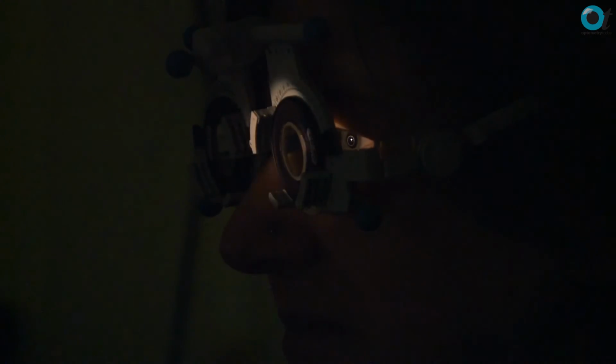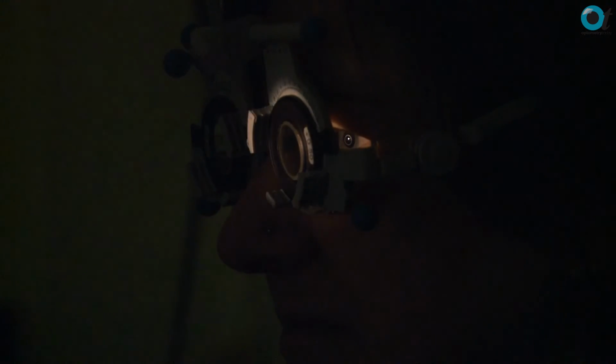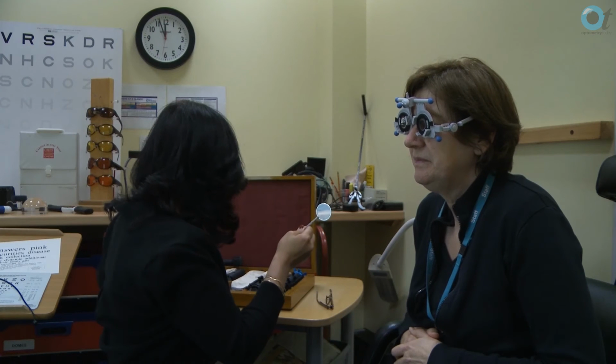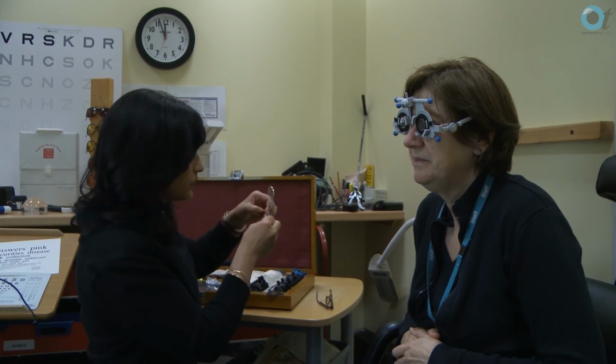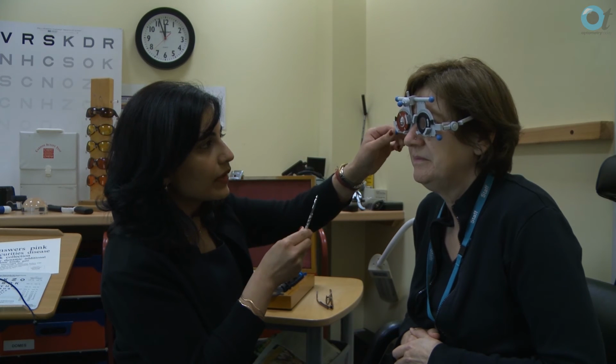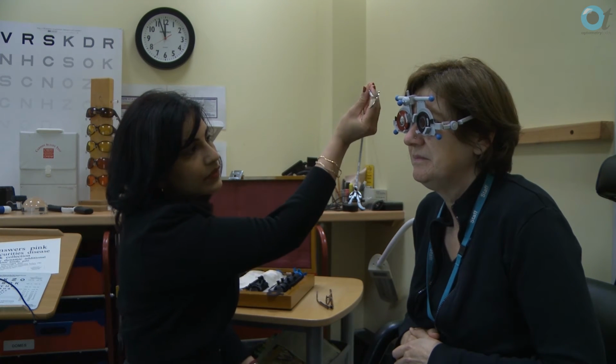For example, spending too long on a subjective refraction on an eye that perhaps only sees 2/60 is quite demoralizing for the patient, particularly if the other eye has a better VA. From a patient's perspective, it is important to make an appropriate choice of where to place the test chart initially.